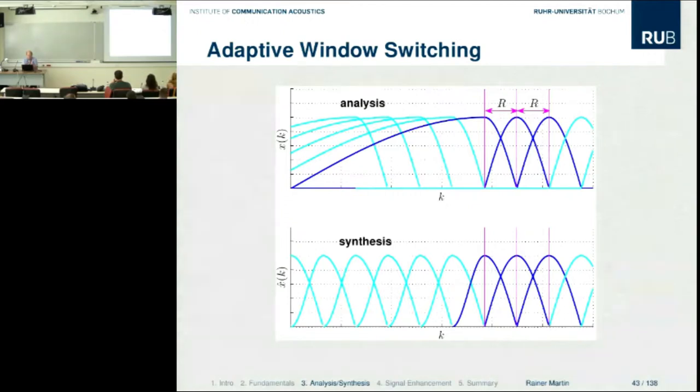The trick is really to always use a short synthesis filter. By making the synthesis filter shorter, you can make this latency arbitrarily short. Yes, there are clearly disadvantages, for example stop-band attenuation, so there is this kind of trade-off. You can only make it very short if you do not downsample much in between. If you want a high downsampling ratio between your time domain signal and your frequency bands, then you also need a decent synthesis filter. Otherwise, you have too many distortions.